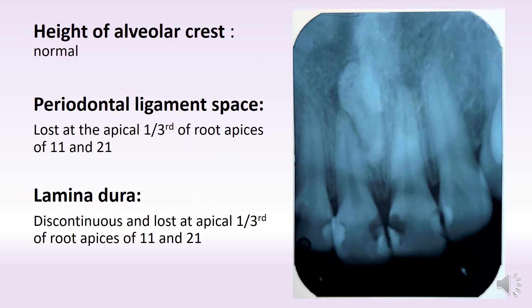So moving on to the height of the alveolar crest — what do we see? We see that it looks normal. This is the CEJ, and the height looks absolutely okay, around 2-3 mm below the CEJ, which is absolutely fine.